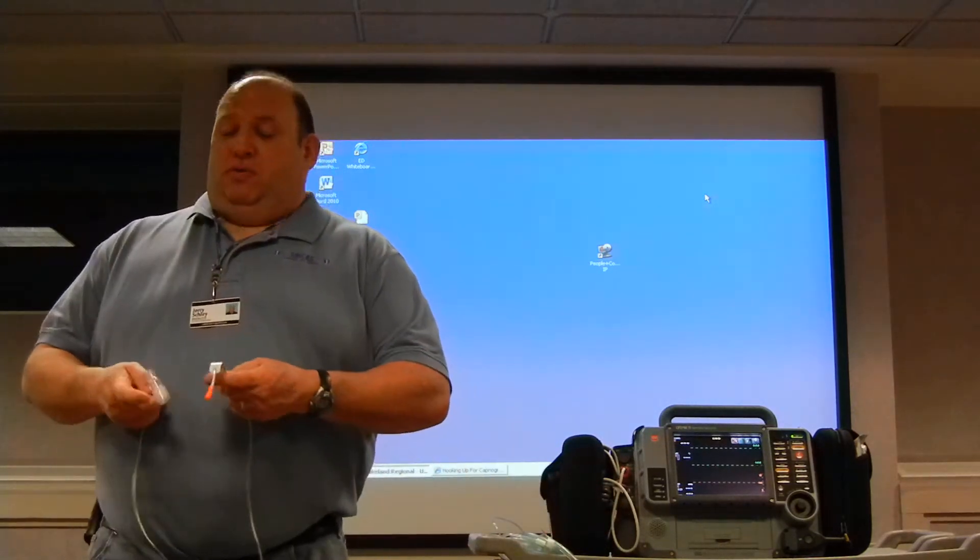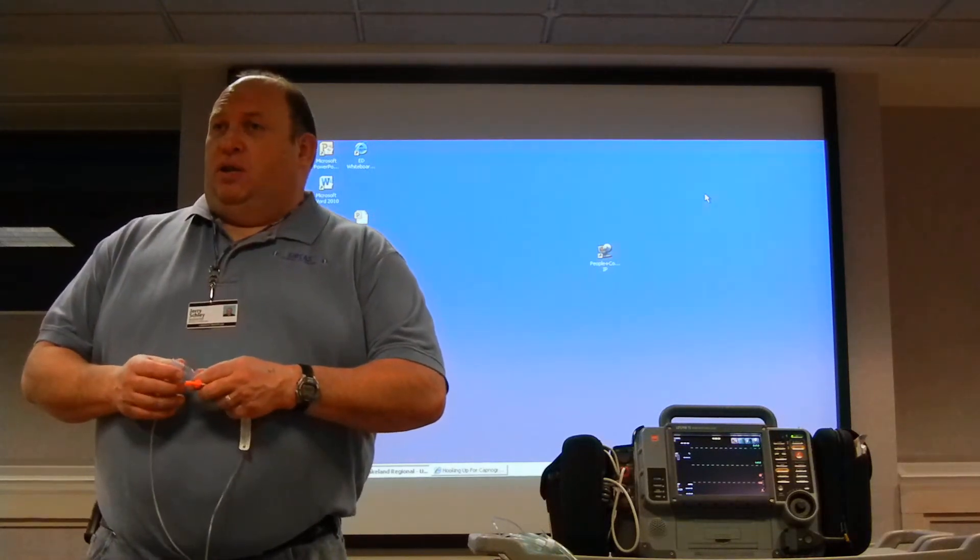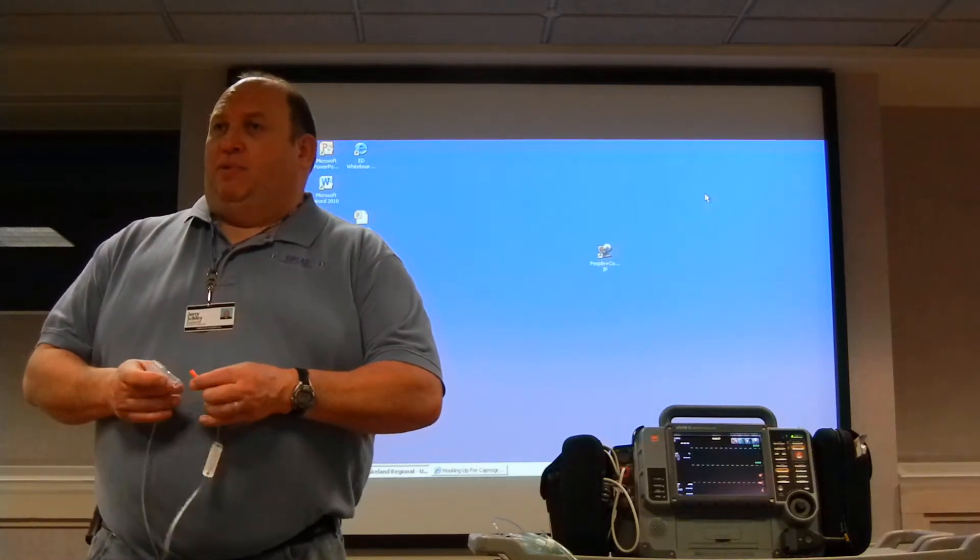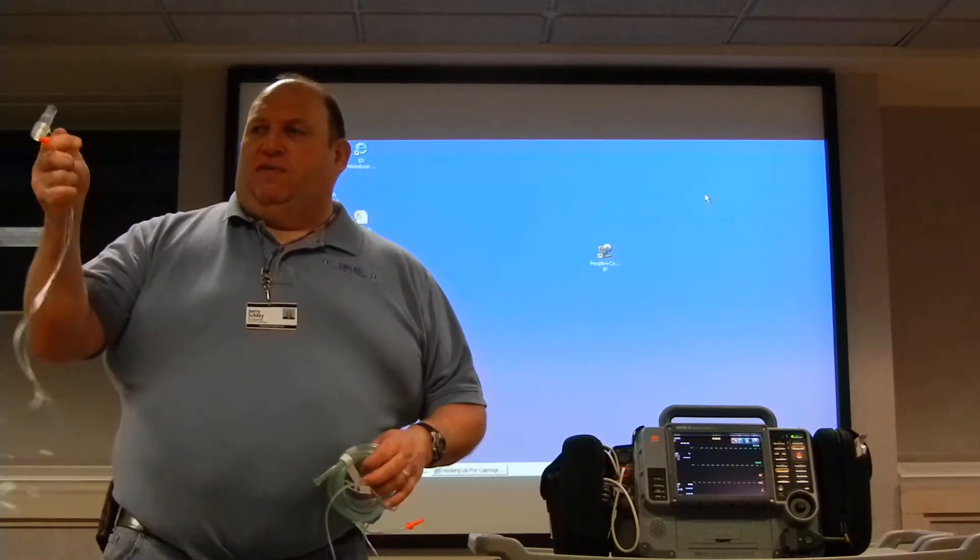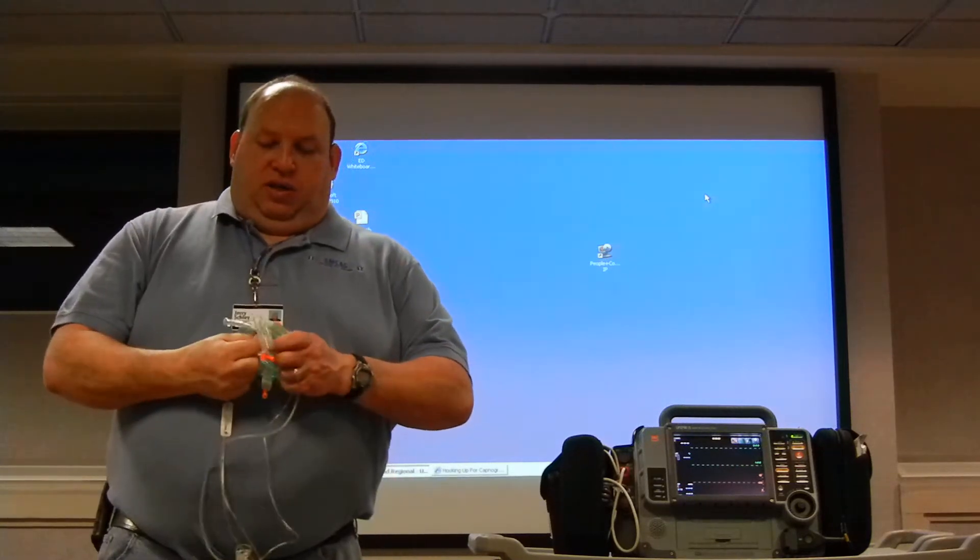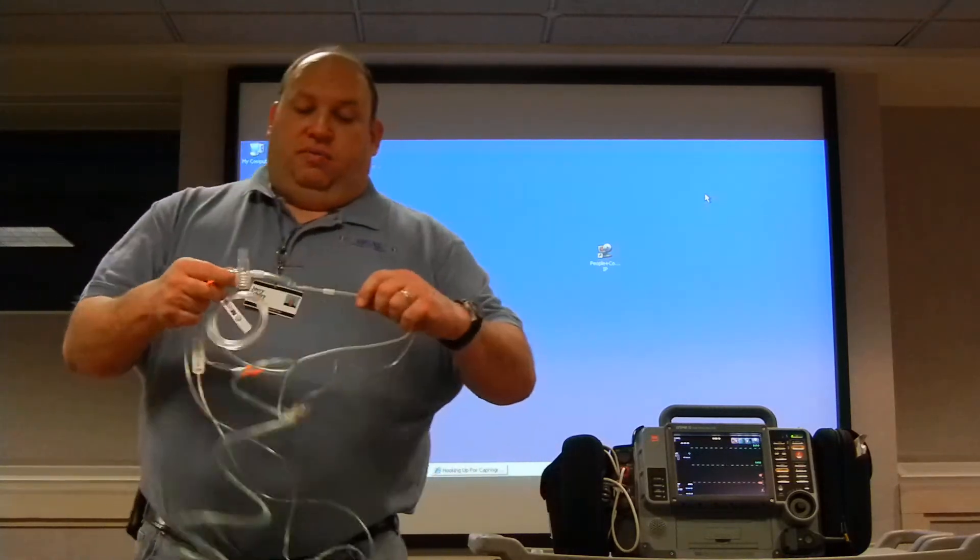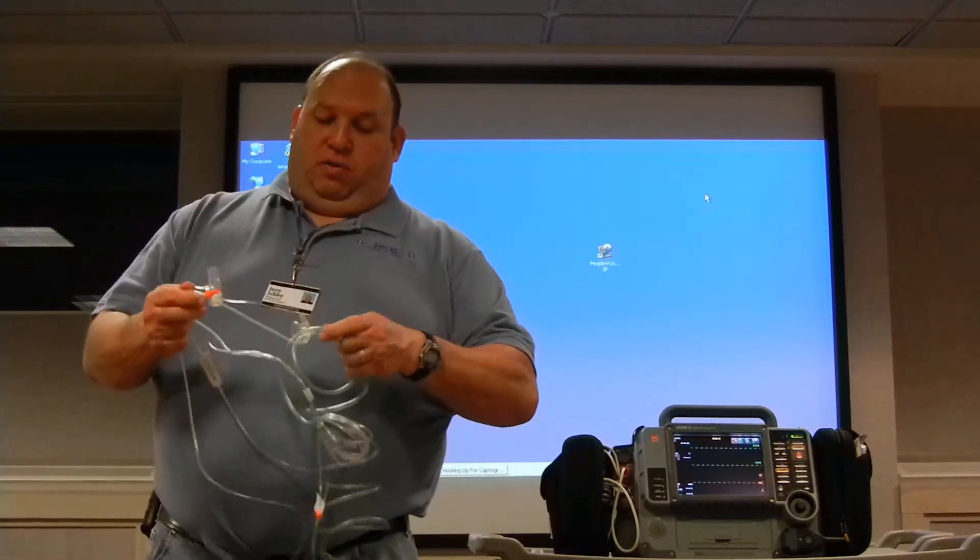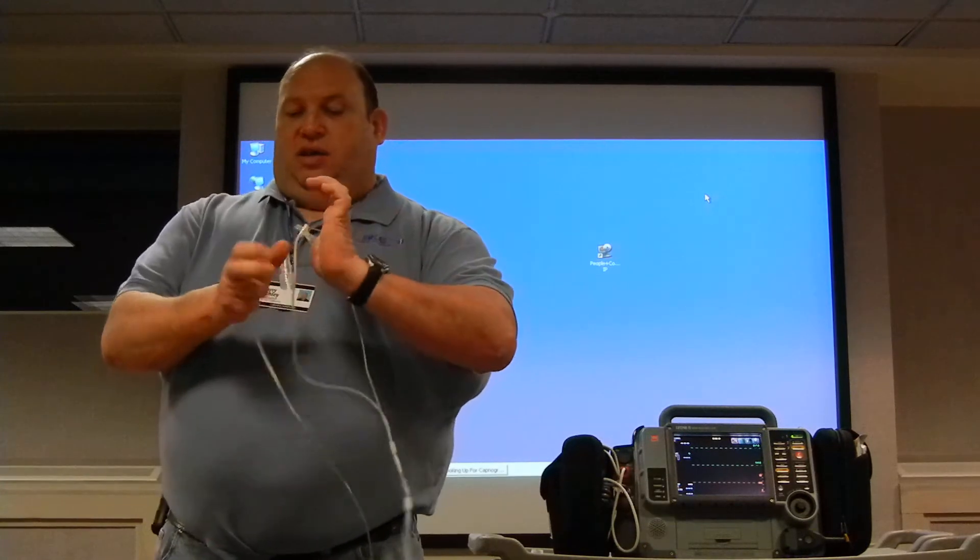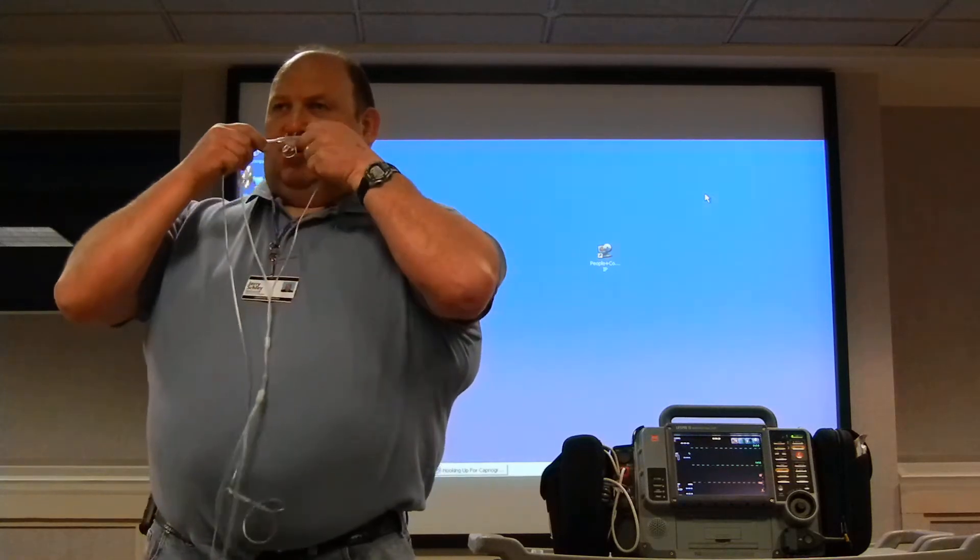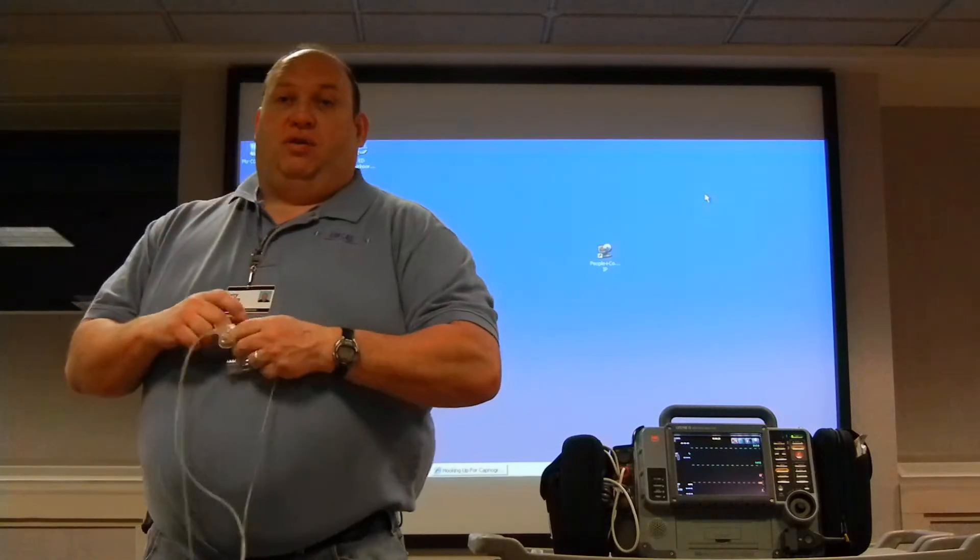So it is possible if you're working with a PCA pump that you could run into waveform capnography. There's two different units that you'll be able to use. This one right here goes on the end of an endotracheal tube, and this unit here looks a lot like a nasal cannula because that's essentially what it is - a nasal cannula with a capnography unit built in. So instead of the normal unit that you would expect to see, you have a cannula with this little flap. As the patient exhales into the flap, it goes down this tube and into the unit and measures their end-tidal CO2.